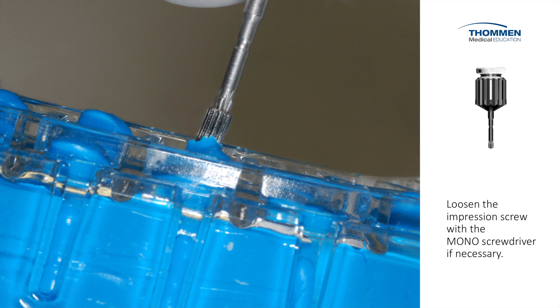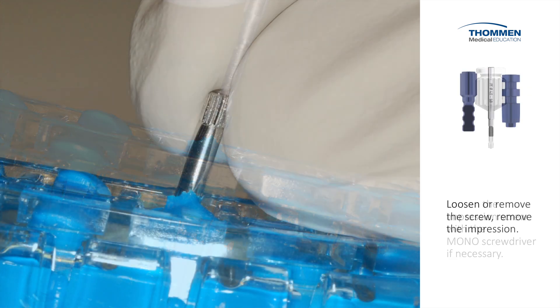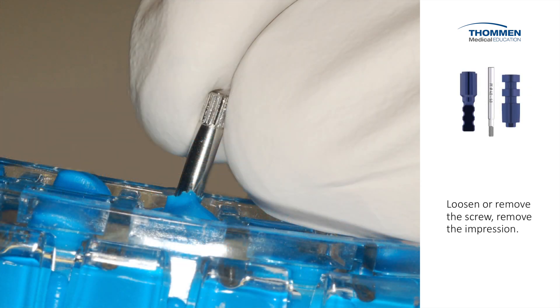After the material is set, we loosen the impression screw by hand or we use the mono screwdriver if necessary. Before removing the tray, we pull up the impression screw to make sure it doesn't interfere with the removal of the impression tray and coping.